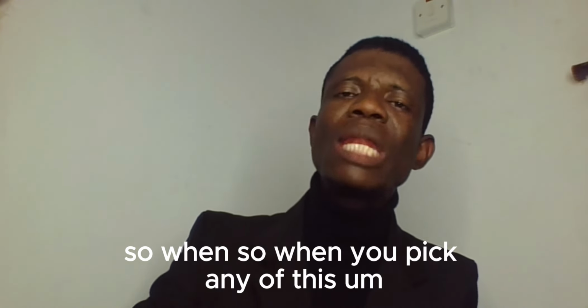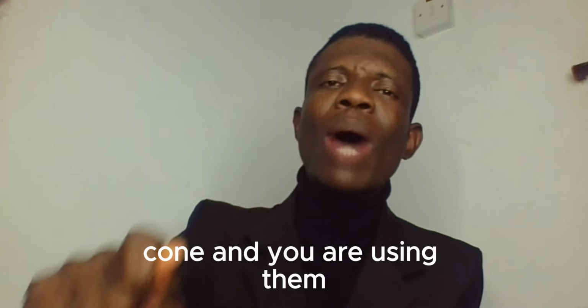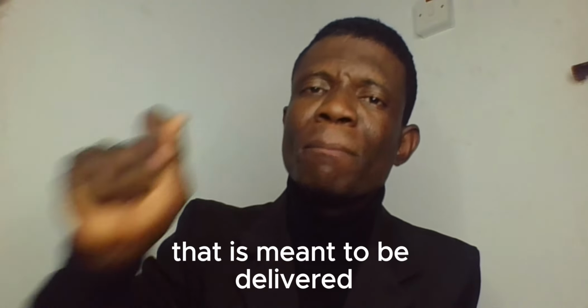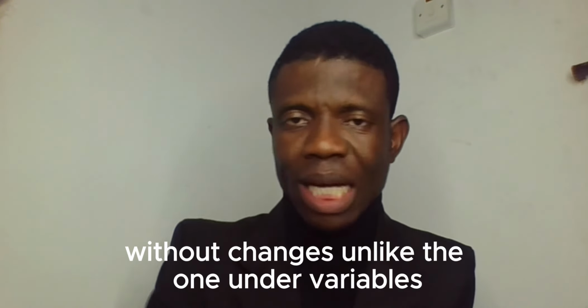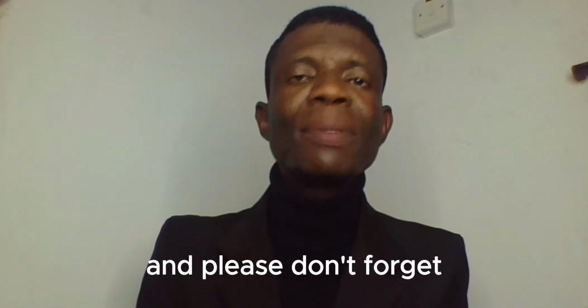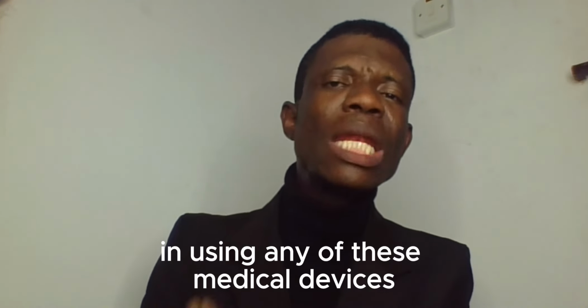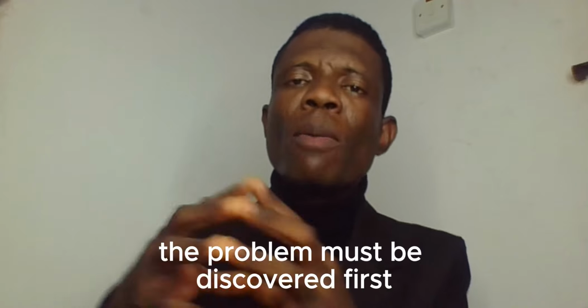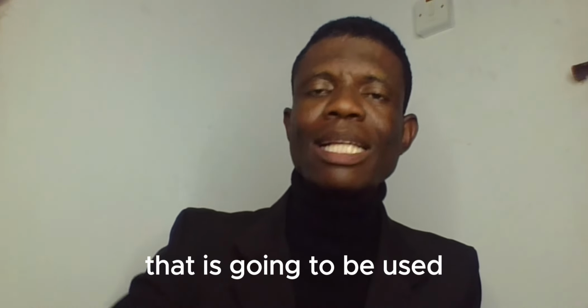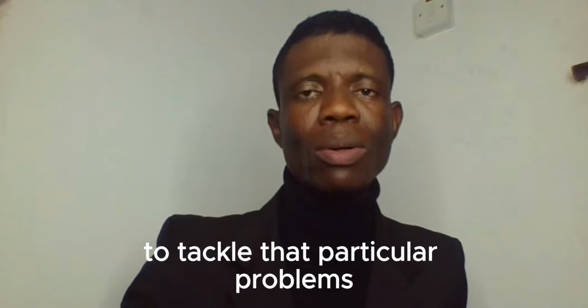When you pick any of these cones and you are using them, they deliver that same percentage of oxygen that is meant to be delivered without changes, unlike the ones under variable. And please don't forget, in using any of these medical devices, the problem must be discovered first before knowing the kind of device that is going to be used to tackle that particular problem.